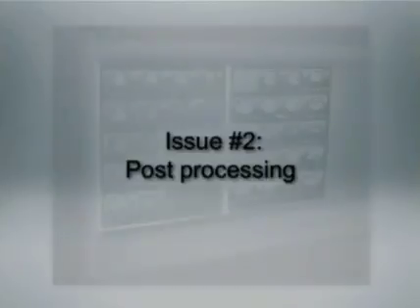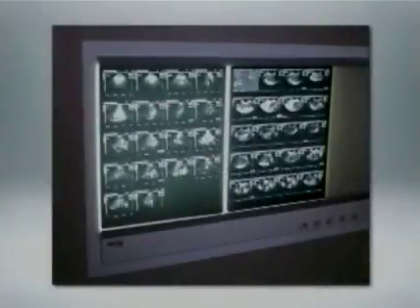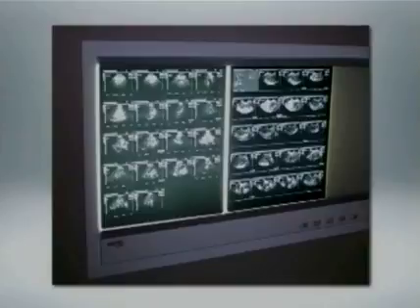The second issue has to do with post-processing. And again, if you're old enough to remember the days of film, back when we used to read ultrasound on film, you know that the type of processing I'm talking about was the film processor. Those were not fun days.